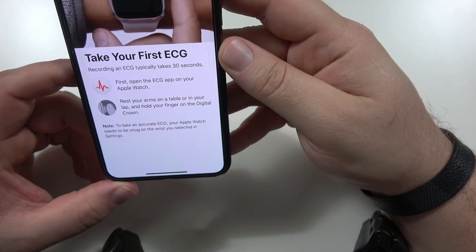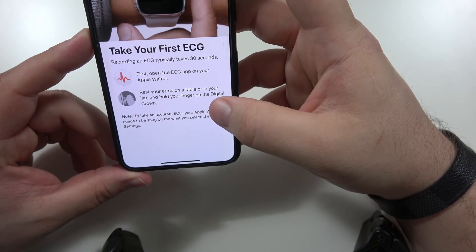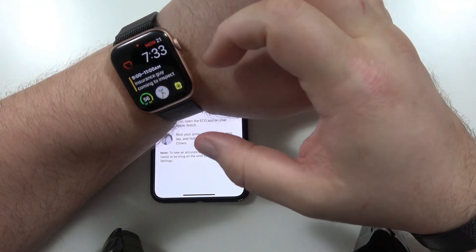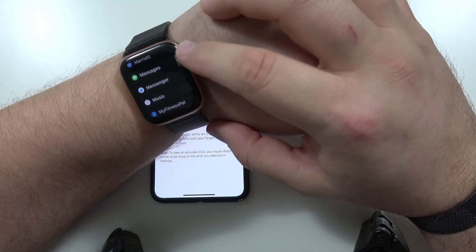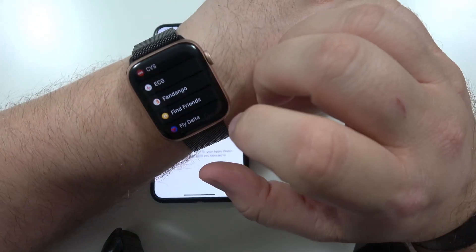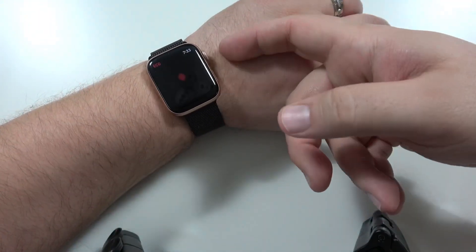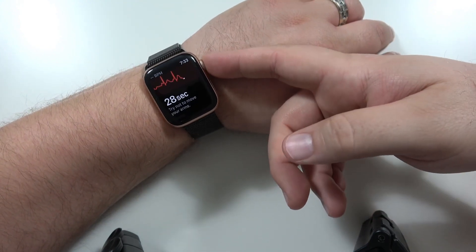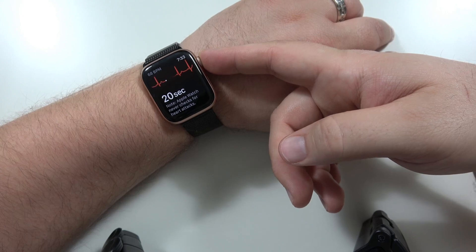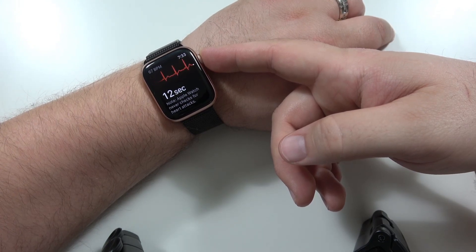Recording an ECG typically takes 30 seconds. First, open the ECG app on your Apple Watch, rest your arms on a table or in your lap, and hold your finger on the digital crown. Oh look, there's an ECG app right there. So it says rest it on the table — here we go — and put your finger on the digital crown. Try not to move your arm. It doesn't say don't talk, so... My finger is on my digital crown and magic is happening. This is the Apple Watch ECG.